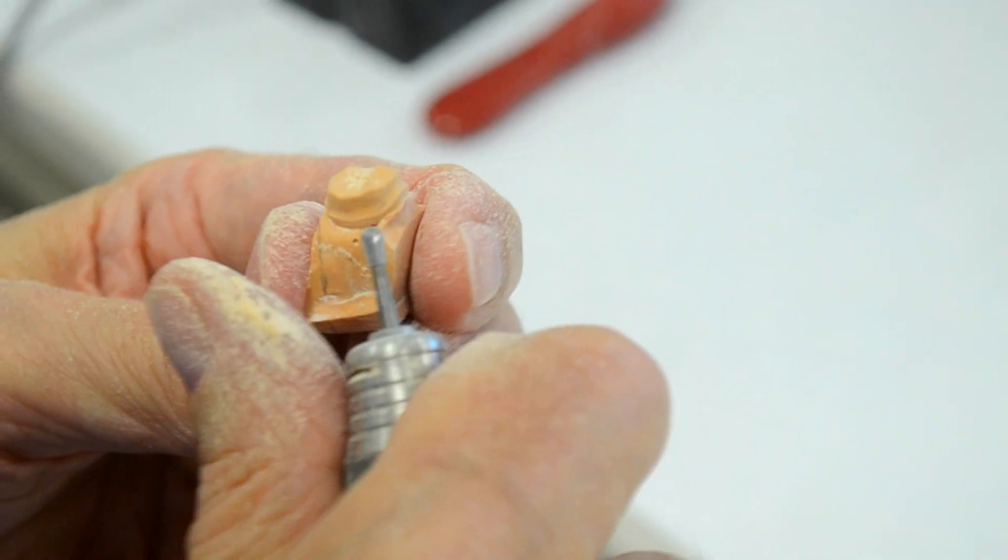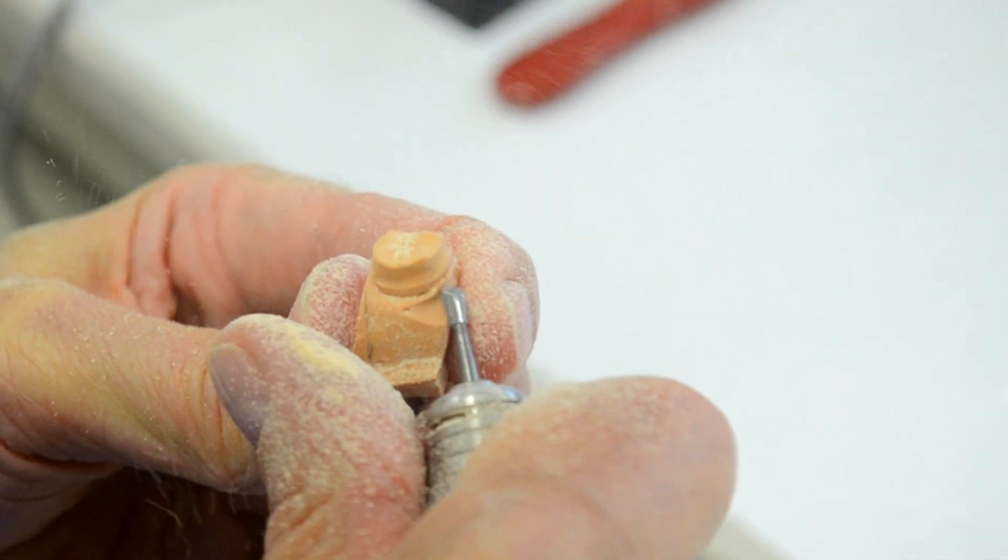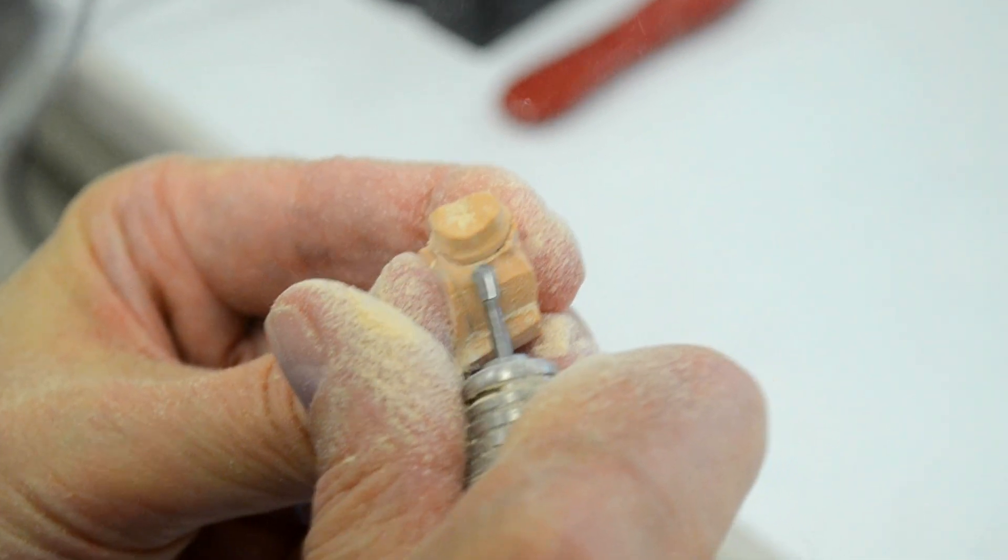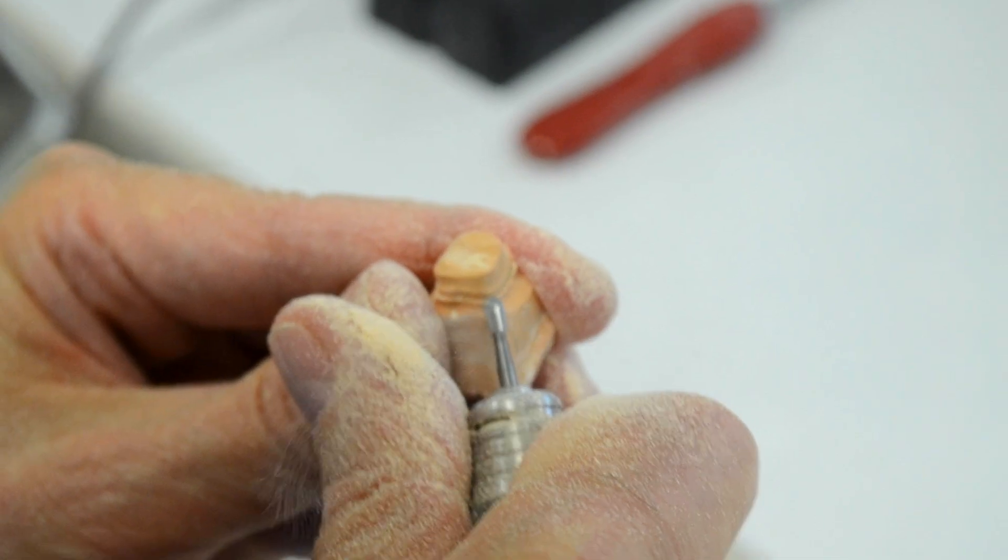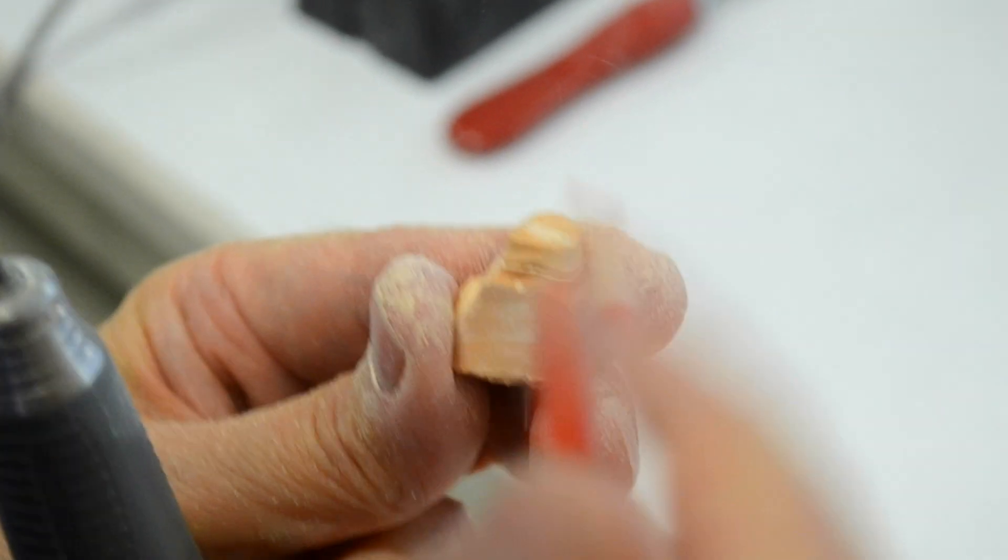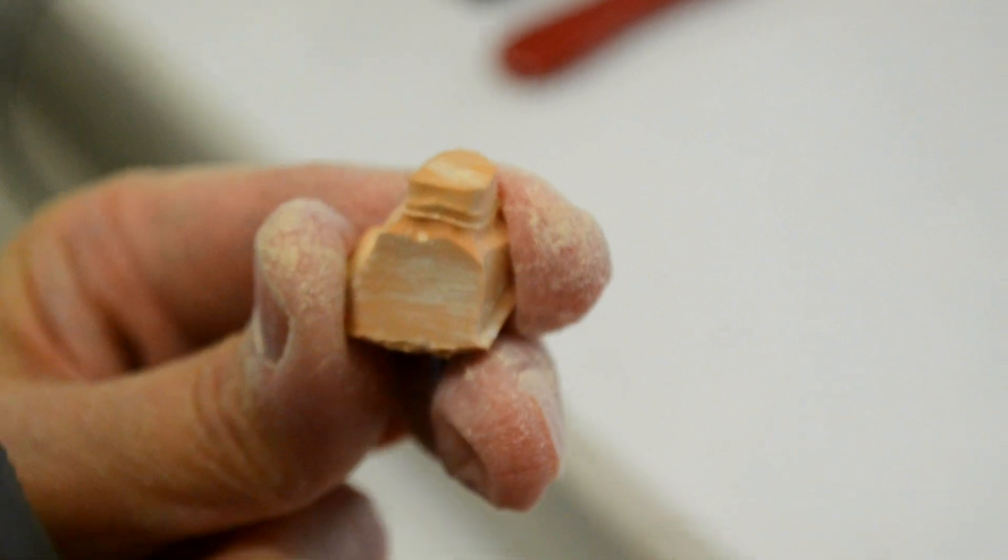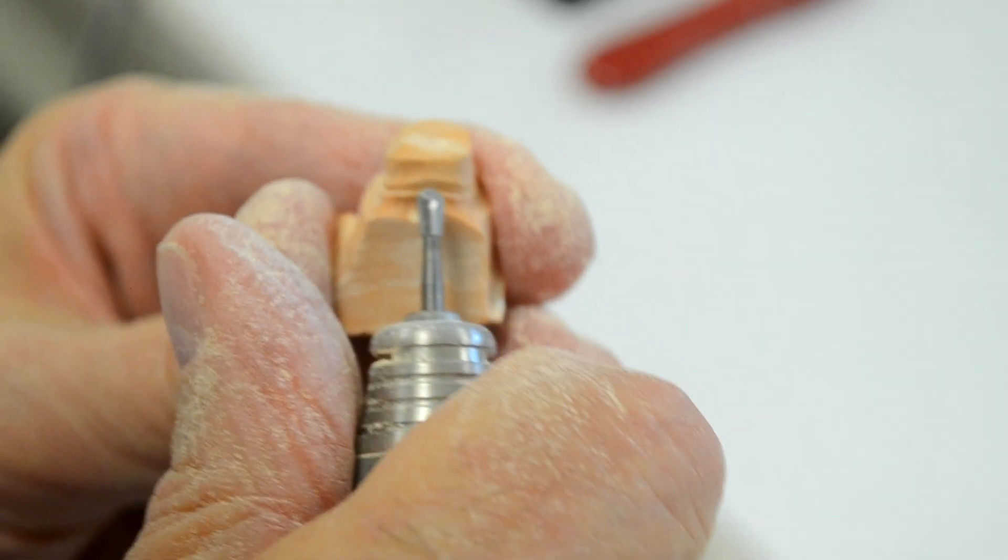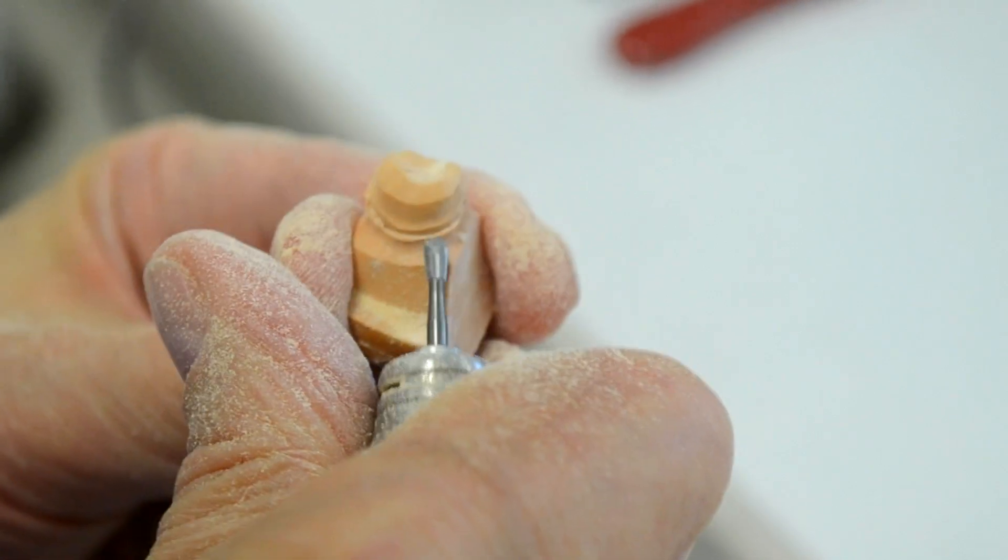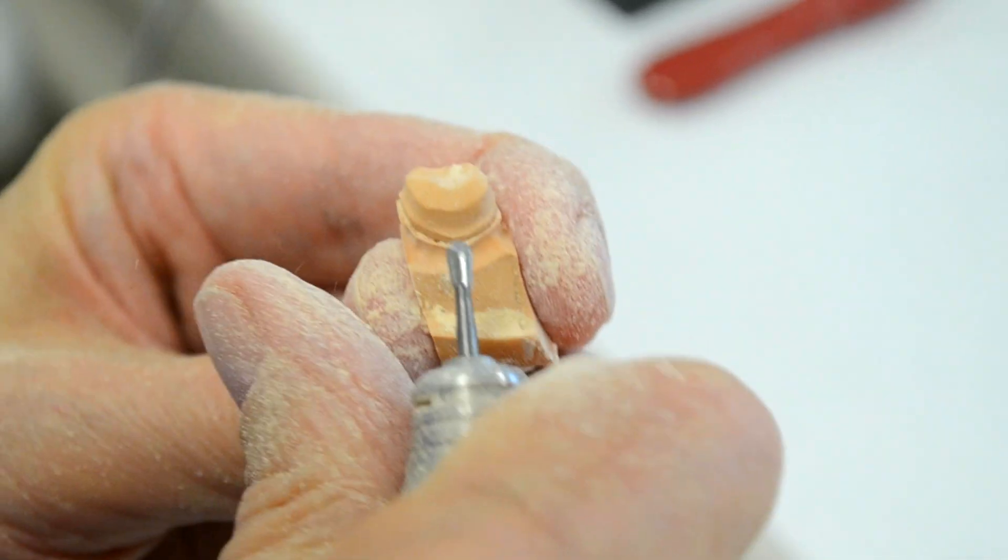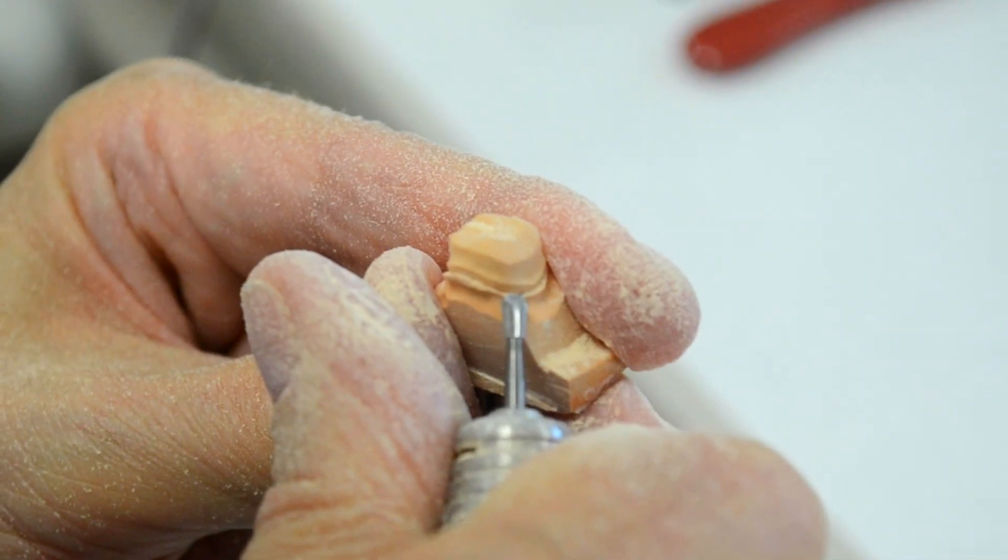Essentially what we're doing is we're undermining the stone that comprises the free gingival margin. By undermining the stone, as you can see, we're left with a small lip of gypsum here that represents the free gingival margin. Again, I continue to undermine this area without going anywhere near closer than about two to three millimeters of the finish line on the tooth preparation.